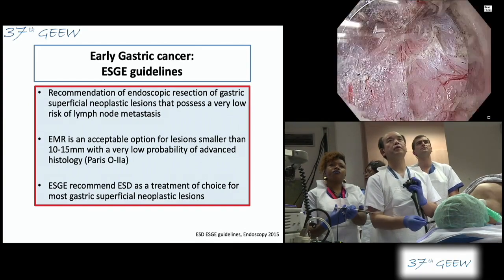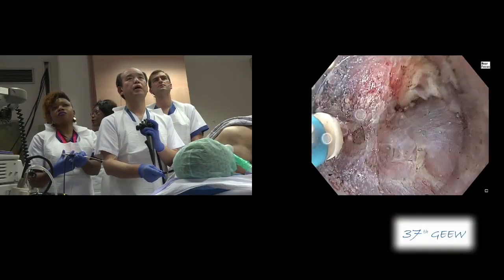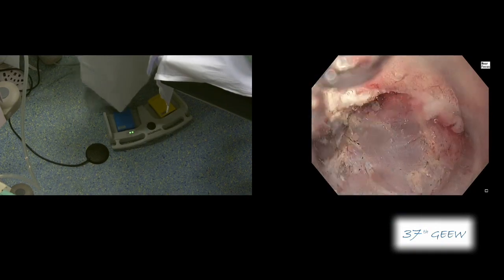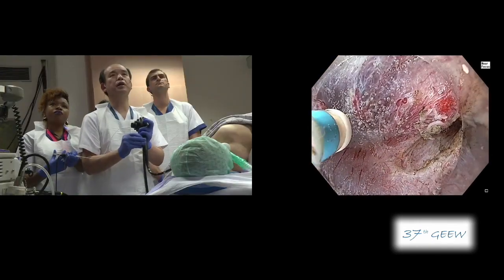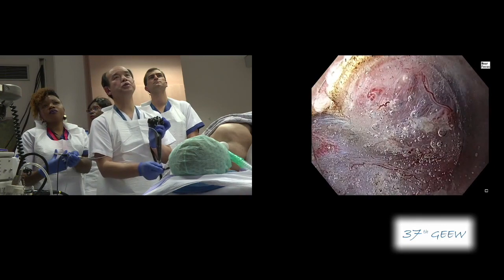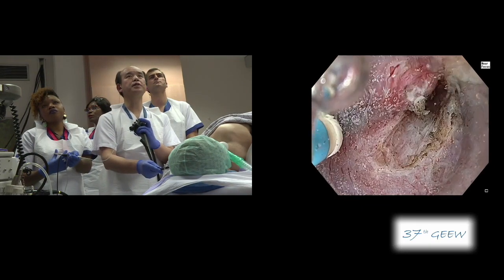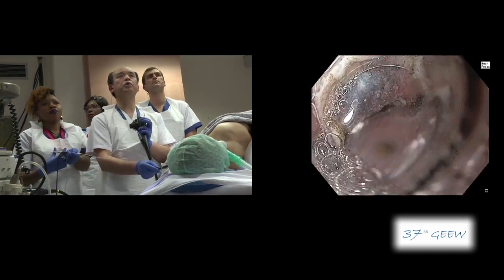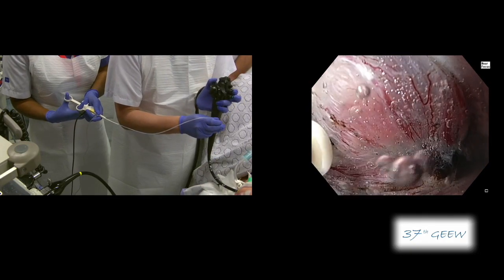Professor Yagi, I have noticed that you use the immersion water pressure technique a lot, like yesterday. Is it really helpful in this case? Yes, because this area is very close to the pyloric ring and sometimes it is very difficult to open the submucosal space. That is why I use the water pressure method to open the submucosal layer — then we can clearly visualize it. In the case of a lesion located at the lesser curvature of the stomach, we can use gravity during submucosal dissection and do not need the water pressure method. It completely depends on the size and location of the target tissue.